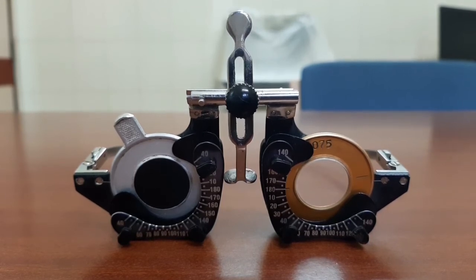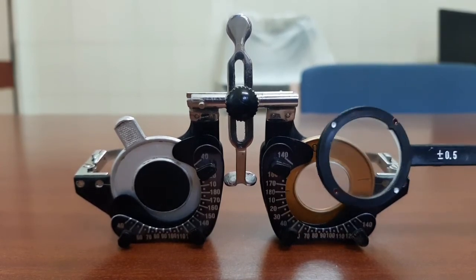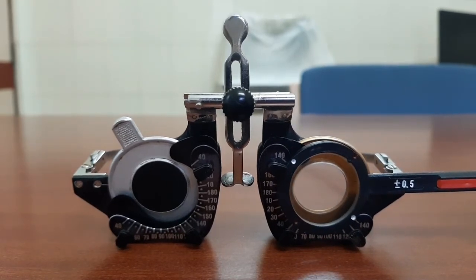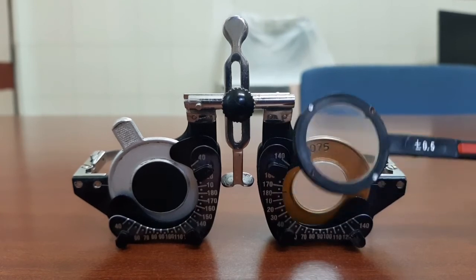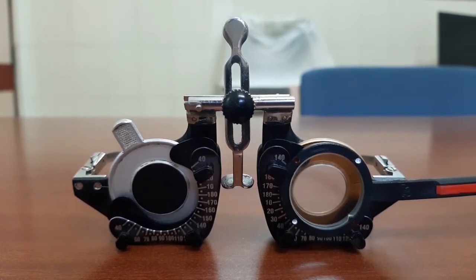After that, use the Jackson's cross cylinder. To check the axis, always make sure that the handle of the Jackson's cross cylinder corresponds with the axis of the cylinder — so the handle is placed at 180 degrees. Ask the patient to look at the chart and concentrate on the letters, then flip it. This process of turning the Jackson's cross cylinder is called flipping, and hence this procedure is also known as the flip cross procedure.